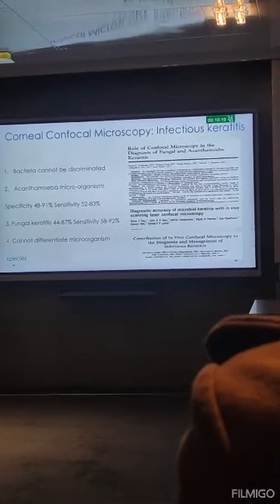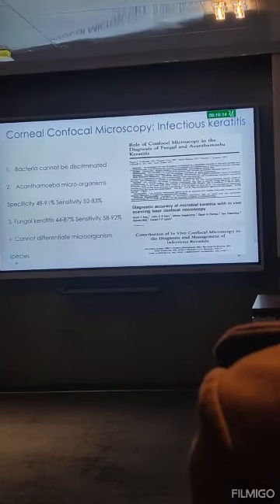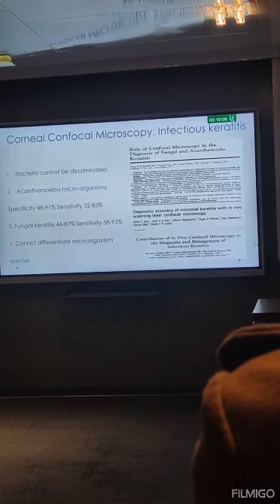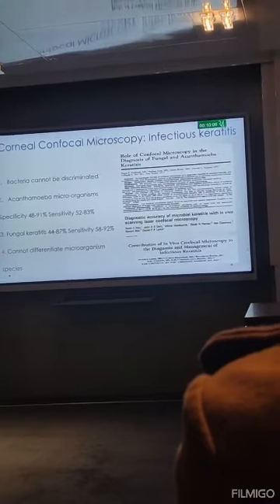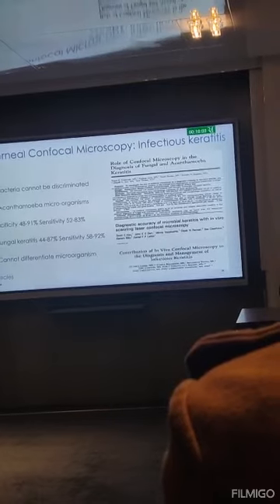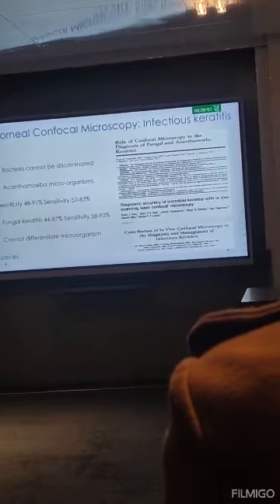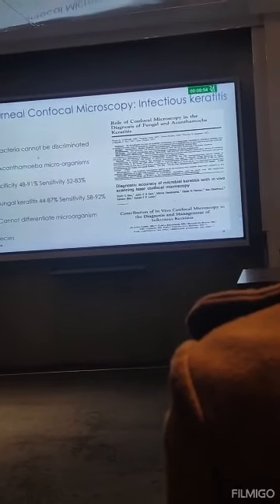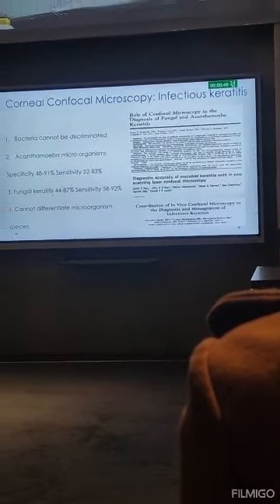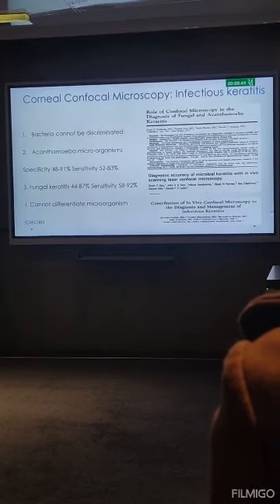The majority of the cases are asked for diagnosis of infectious keratitis. So keep in mind that bacteria cannot be discriminated because bacterial elements are smaller than the resolution of the microscope. So you will never image bacteria. If you suspect bacterial keratitis, there is no indication for IVCM. But it's very useful for acanthamoeba and fungal keratitis, with a high level of sensitivity and specificity.